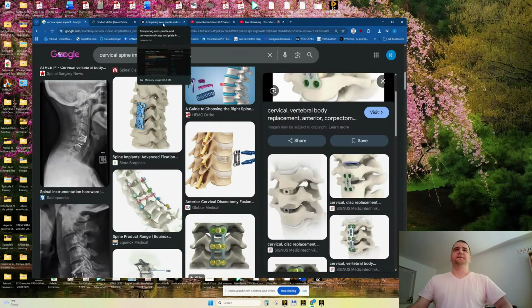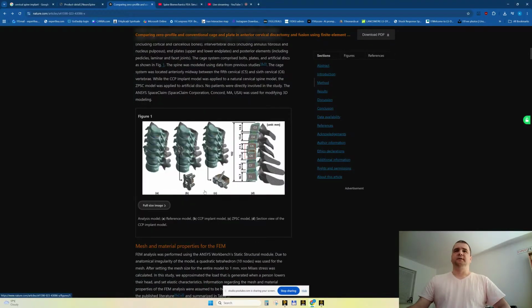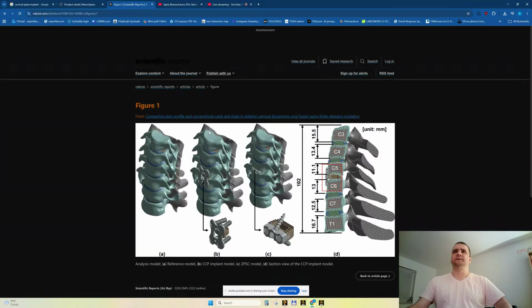I said that there is this article from the Nature paper, which we know I think is number one in the scientific literature. And my purpose is to kind of imitate or get inspiration from this paper. So I would like to do something like we see here. We have a plate, screws, and a fusion cage, and this is the middle case. Let's say I will not waste time with the before, with the healthy spine, and I didn't find this 3D model, so I'll not deal with this, only the middle case.